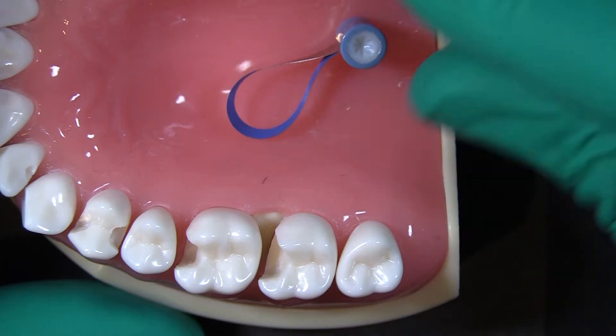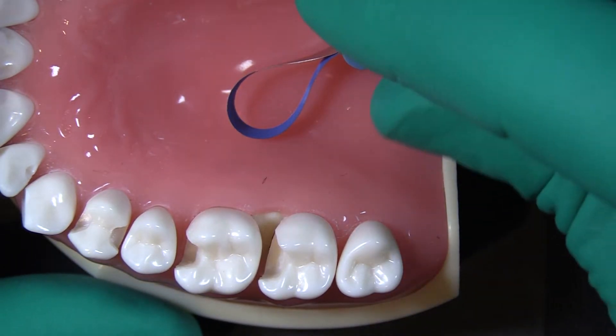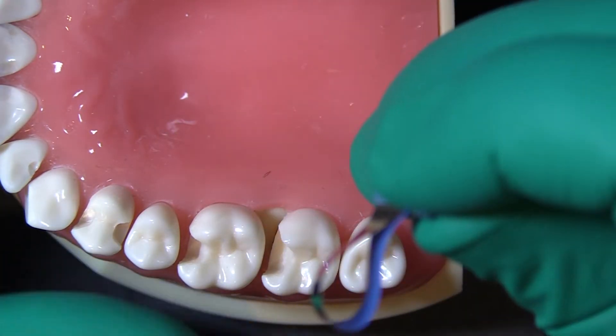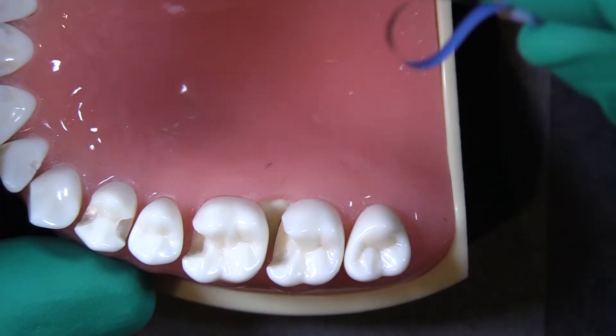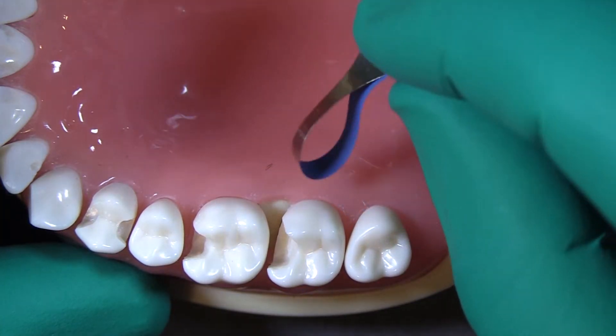If I can get a wedge in, I prefer to use a sectional matrix band. If I can't get a wedge in — either because I don't want to remove gum tissue, or because I removed gum tissue but am still having trouble with the distance from the bone to the prep — in those situations where it's not possible to get a wedge in the right location, this is my go-to matrix band.